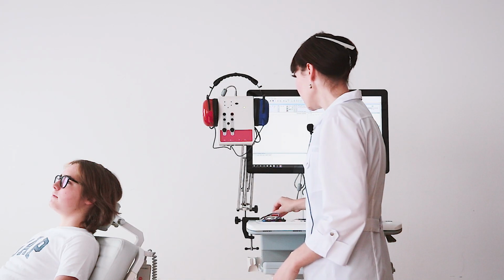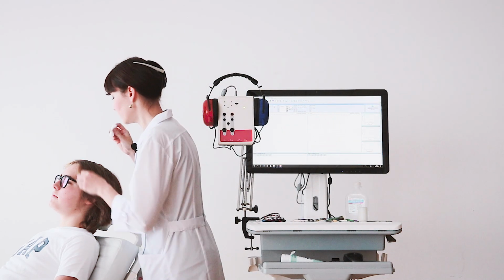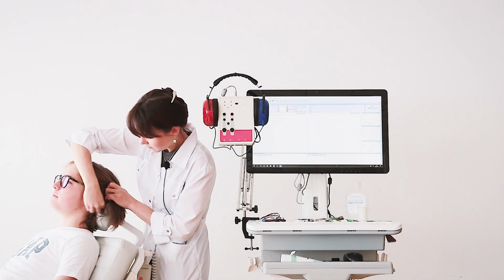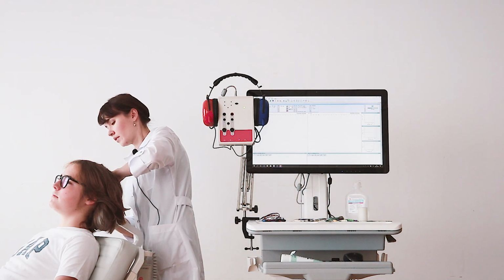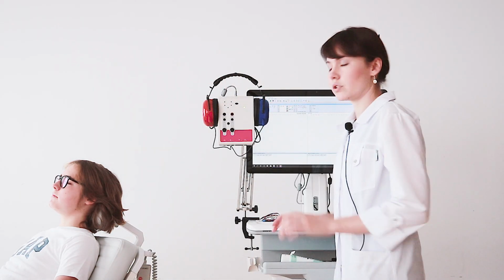Next, we need to use the abrasive paste to peel off the skin, until slight redness. All this allows us to reach good impedance. Now we can put on the electrodes.